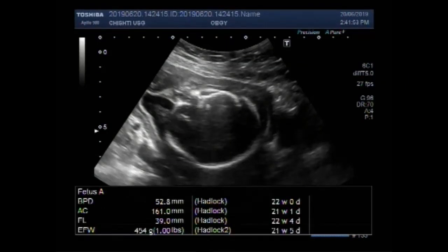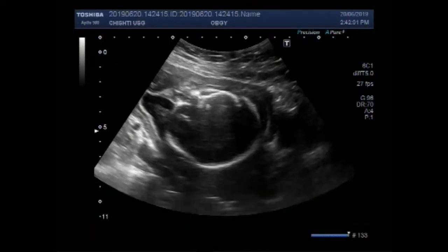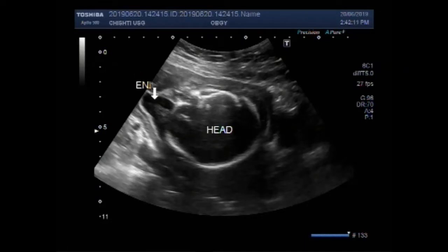Dear viewers, I hope you are all fine. This ultrasound video shows an intrauterine pregnancy with fetal demise, and this is an encephalocele attached to the hind portion of the fetal skull bone.